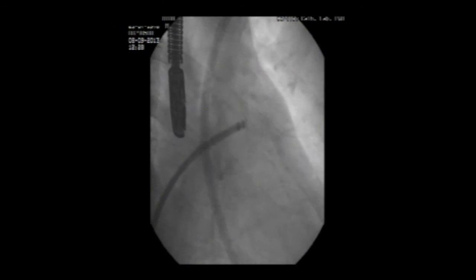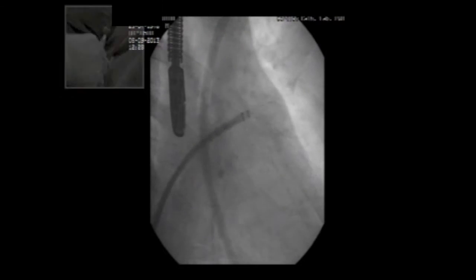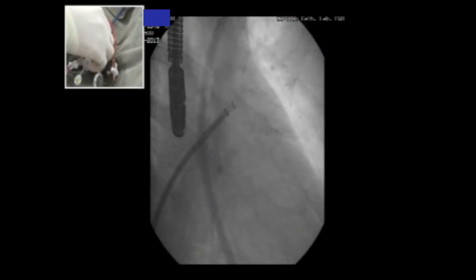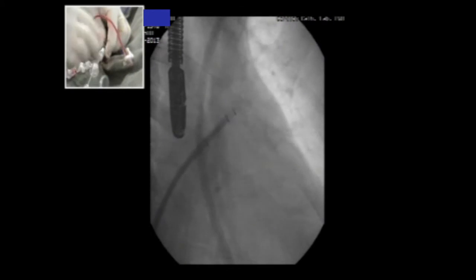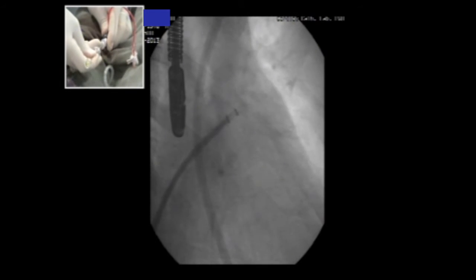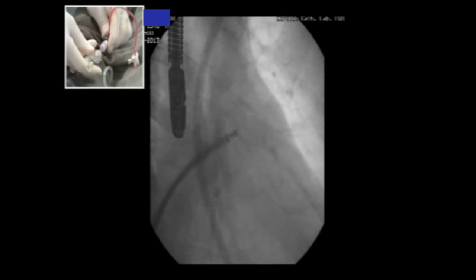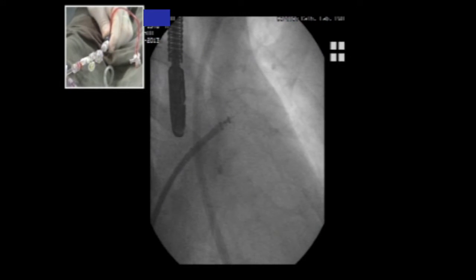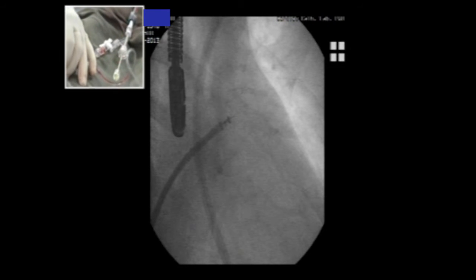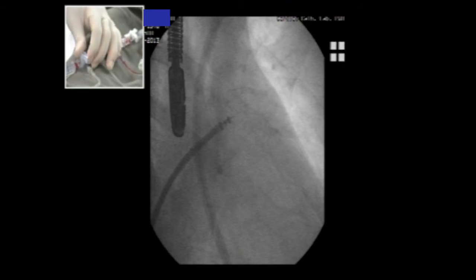So we try to do a partial recapture here. Right. I rotate it a little bit more. That's too much. Oops. It's a little bit different now. But now we have a large shoulder. You see that on echo. We need echo to show the audience.